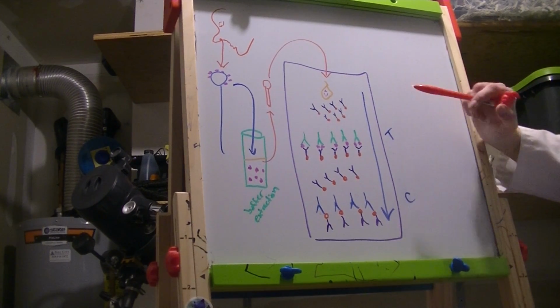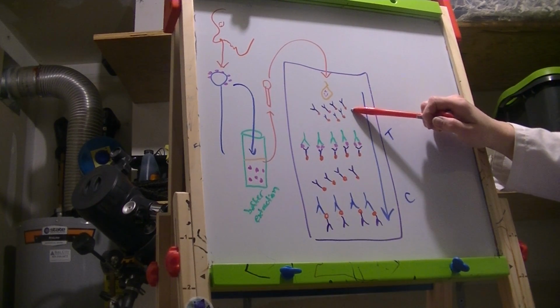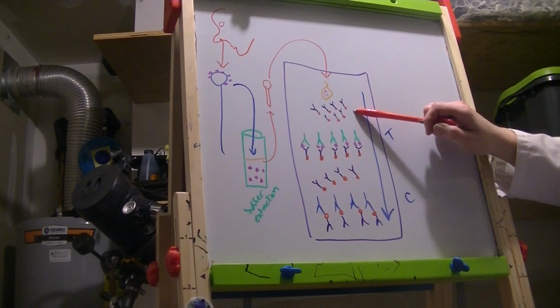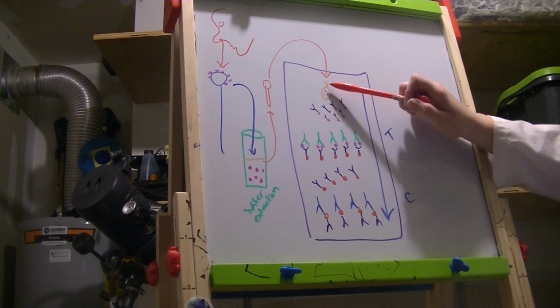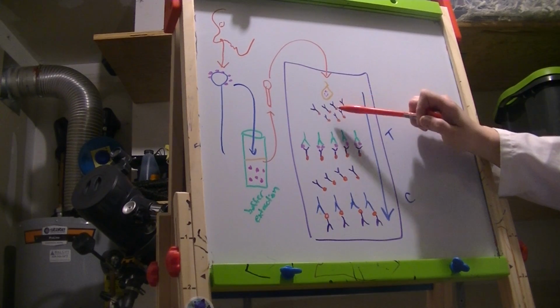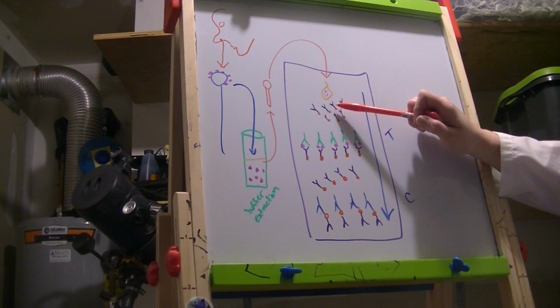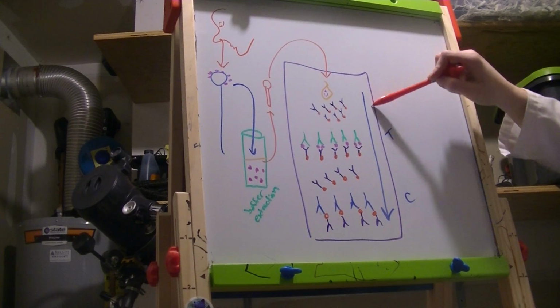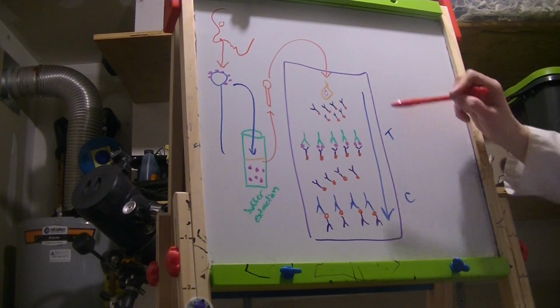There are antibodies against flu A and flu B, and those antibodies have colored particles attached to them, so that if there is flu antigen in the patient's sample, it is now going to be bound up by these antibodies, and the sample is going to travel from the top of the card toward the bottom of the card.